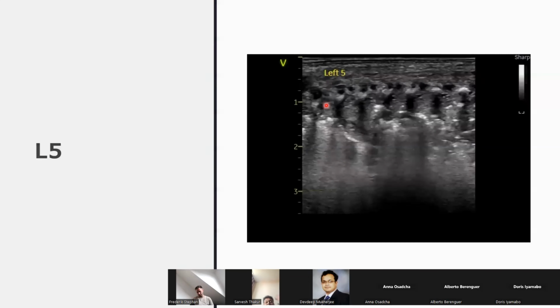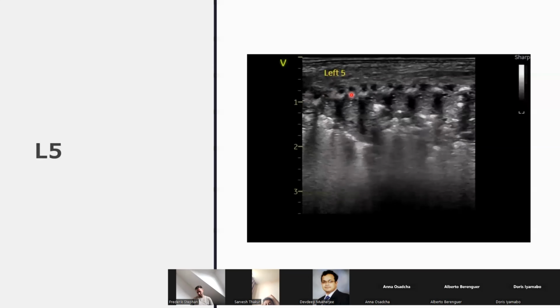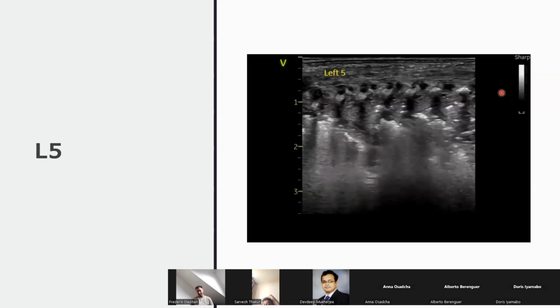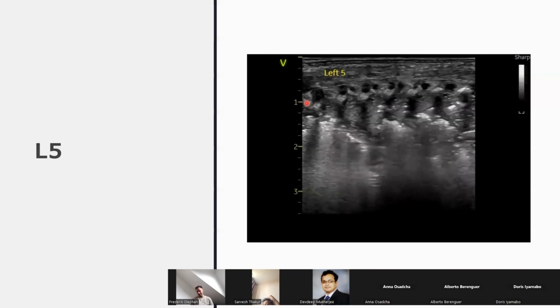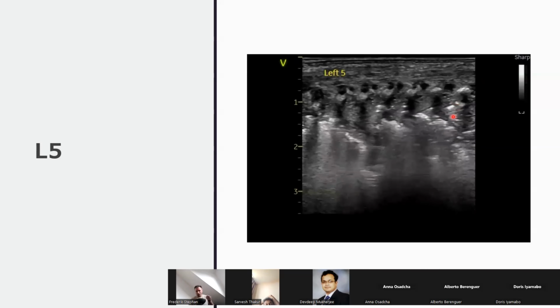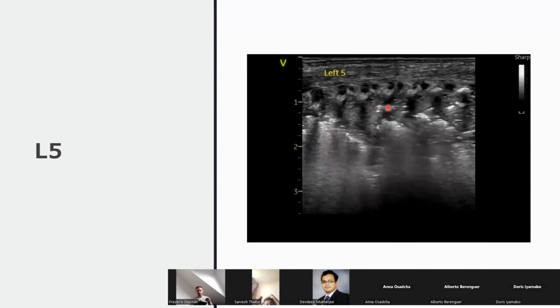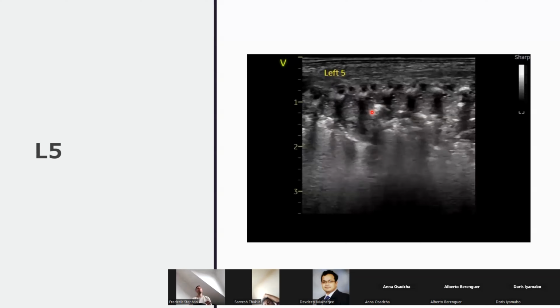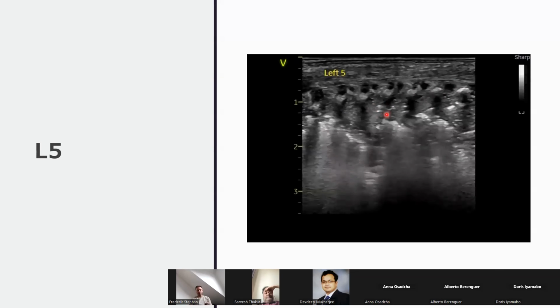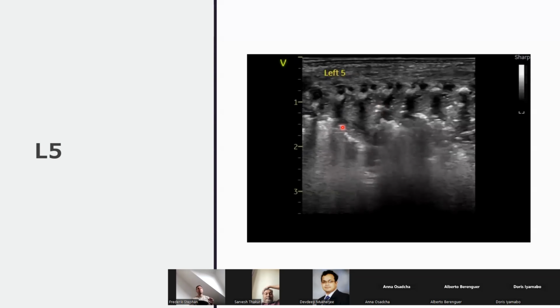So it just gives me a really good area of the geography. But with my batwing sign, I agree, Satish, there's absolutely no pleural line visible here. And really what we've got is this area of hepatization with a lot of static air bronchograms. This area here is not a dynamic air bronchogram. It just appears and disappears with inspiration, expiration. It's not moving in and out like a caterpillar. So this is still a static air bronchogram that you see. Now, anything else, Praveen?